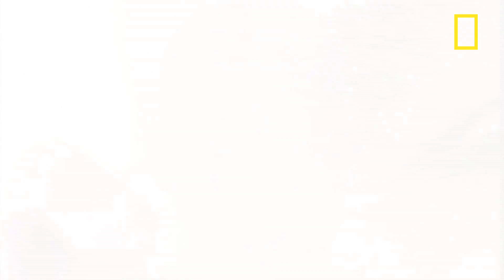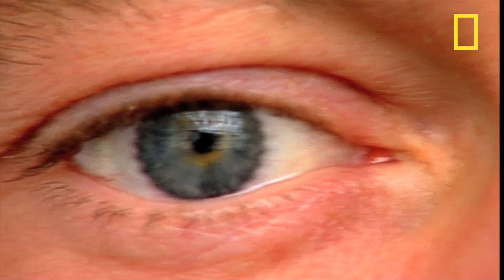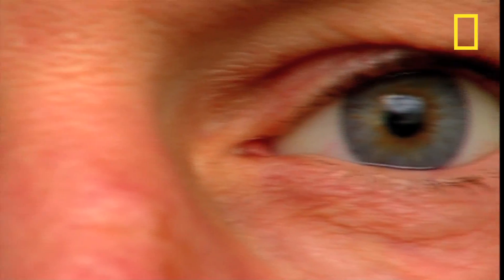Can you tell which one it is? Are you looking hard? Nope, I can't tell either. Okay, it's actually the one on the right of the frame.